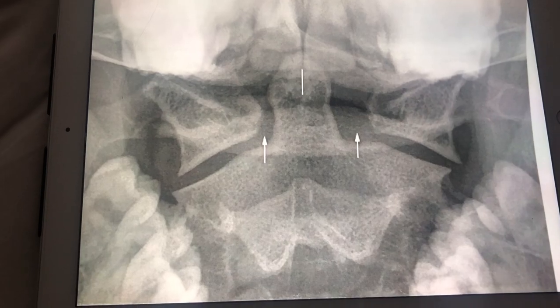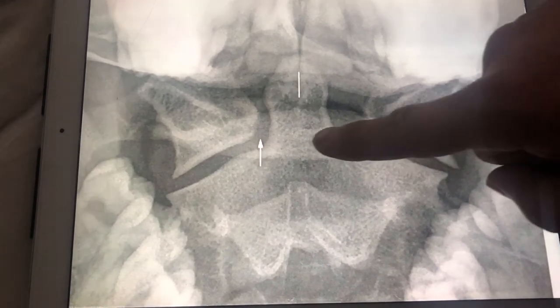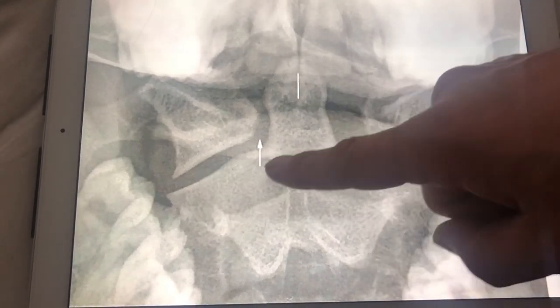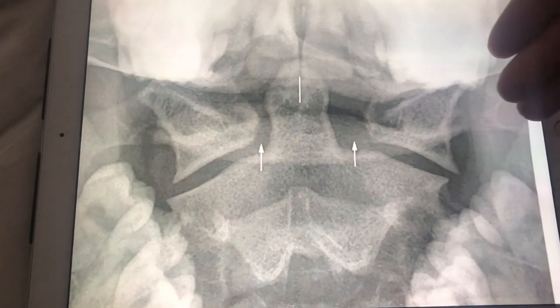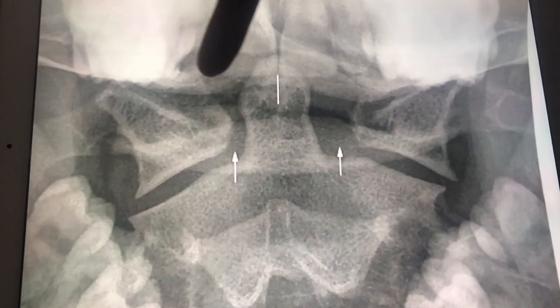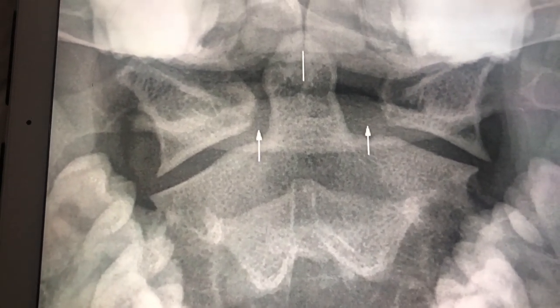We're looking here at an odontoid view and it's perfectly positioned. You have the dens right going through the middle, you've got beautiful joint spaces here, it's not rotated, there's no motion, there's no artifacts, and the top of the teeth are out of the way as well as the bottom of the teeth. You can't ask for anything better than this.